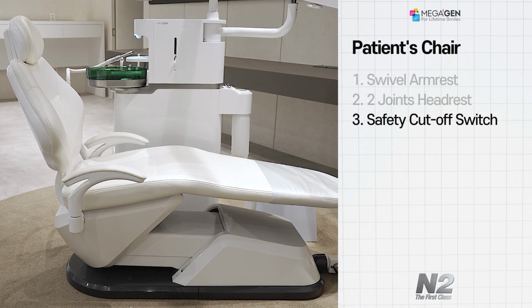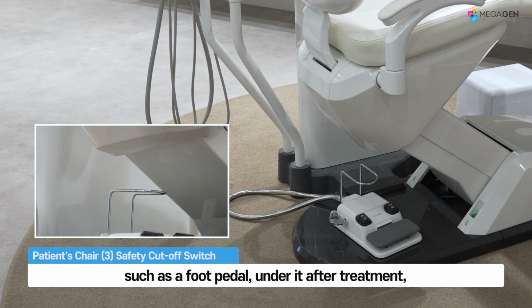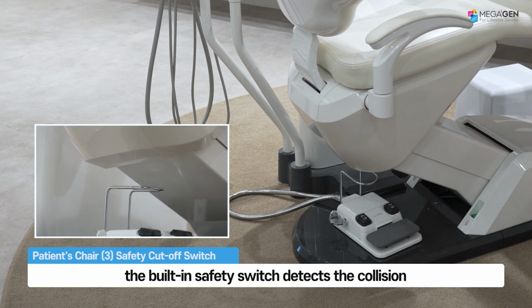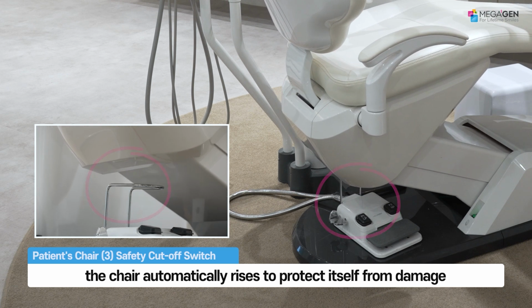Emergency safety switch function of the chair. If the chair lowers with an object, such as a foot pedal, under it after treatment, the built-in safety switch detects the collision. When a collision is detected, the chair automatically rises to protect itself from damage.